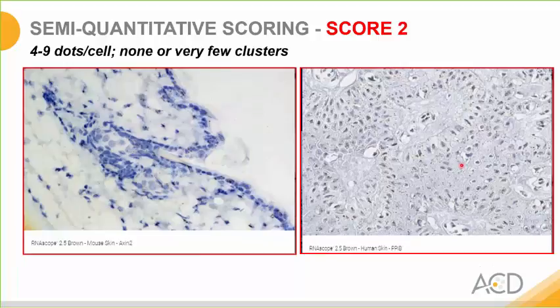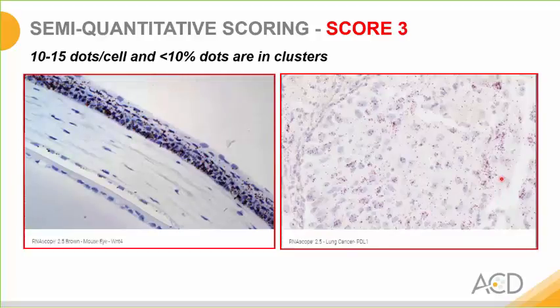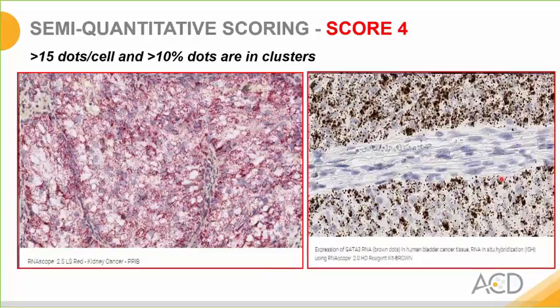These panels show a score of 2, with most cells containing in the range of 4 to 9 dots. Very few of these dots are present in clusters. So this is a representation of score 2. These panels show a score of 3, with most cells containing 10 to 15 dots, with less than 10% of the dots in these cells being present in clusters. And finally, these panels show a score of 4, with most cells containing greater than 15 dots, many of the dots in these cells being present in clusters.